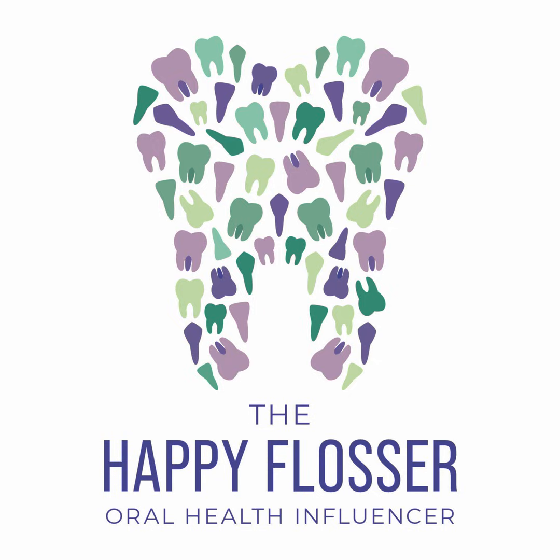The point of the canine can sometimes shift the sensor, so you want to make sure that you look through the ring and that you have it centered correctly. Remember, you're using the blue anterior ring, and the sensor is vertically placed for these anterior shots.